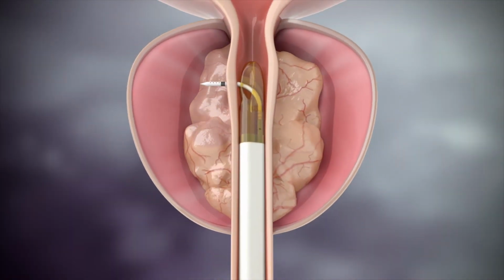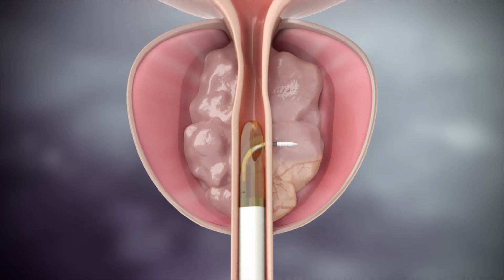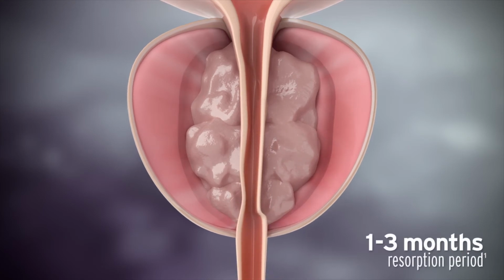And data on Rezum's been very good. The retreatment rate within 1 year is about 10 to 15%, meaning they need something else because the Rezum wasn't able to do the job, and results can last at least 5 years. Rezum works on all sorts of prostates. It's not currently been studied in large numbers for large prostates, meaning prostates over 80 and even over 100 grams. We've had a few patients that we've done, and we've had some results that were good enough, and the patients were happy that they pursued the procedure, but really it's a conversation if the prostate becomes too large.